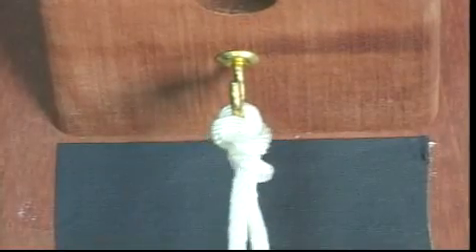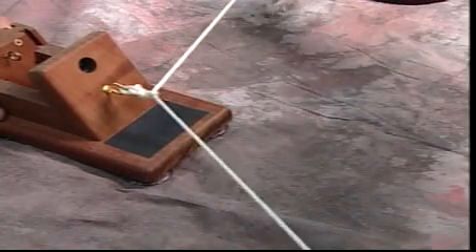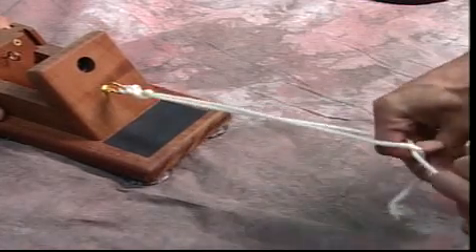We can then drop the loop limb, pull down on the post, bring up our loop limb, apply tension and let off slightly on the post — and that self-locks the knot.